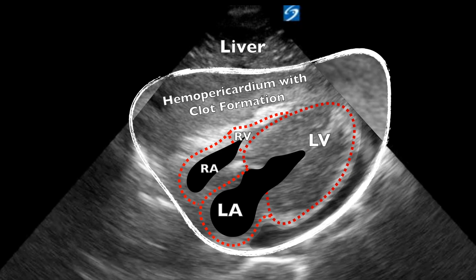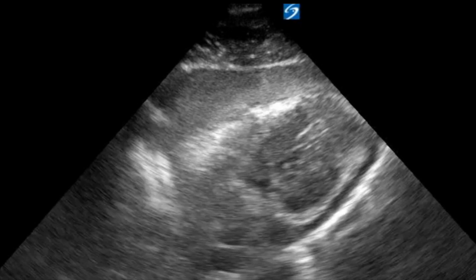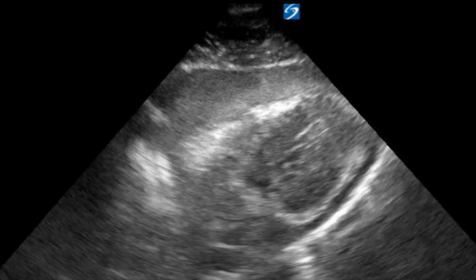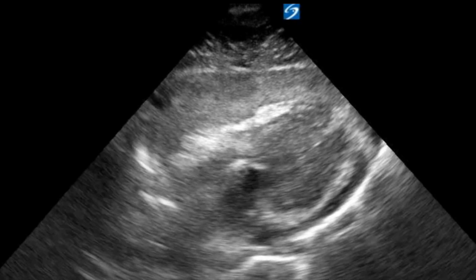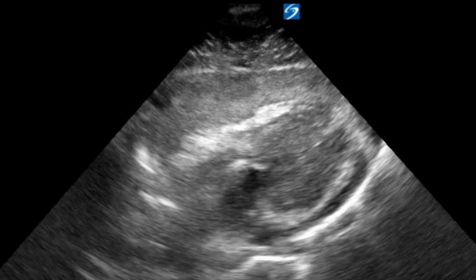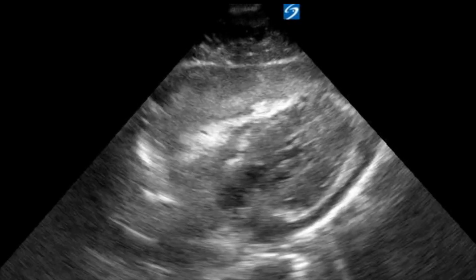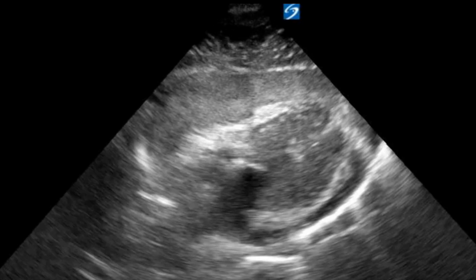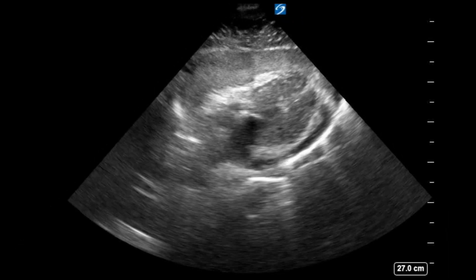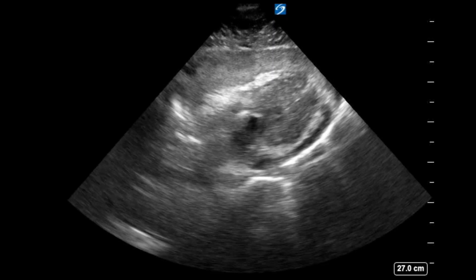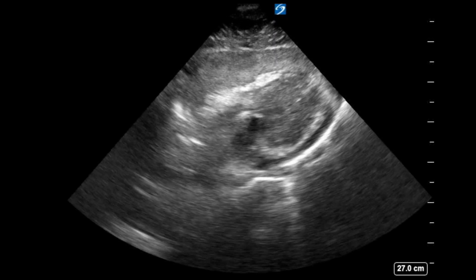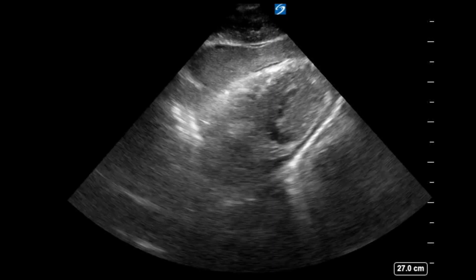In my opinion, if a medical code has a hemopericardium with clot formation, there is more going on than just the heart not beating, and resuscitation is very unlikely to succeed. The bleeding within the pericardial sac has probably led to the demise of cardiac activity. In the video we can see them fanning to discern the chambers. You may notice flickering or shimmering within the chambers where blood would be — that's probably blood clotting. Do not misinterpret that as cardiac activity. All of these signs on this ultrasound are incompatible with life.